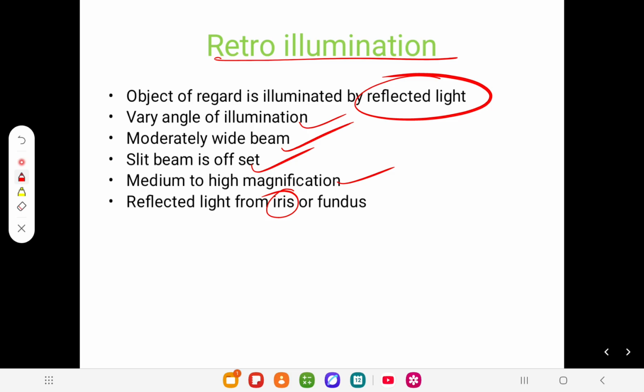If you throw light to the fundus, then structures anterior to the fundus you can see. Sometimes I used to show my students vitreous cells, in good amount, if there is inflammation or anything. I love to show them the vitreous cells through retroillumination. That's quite fun.